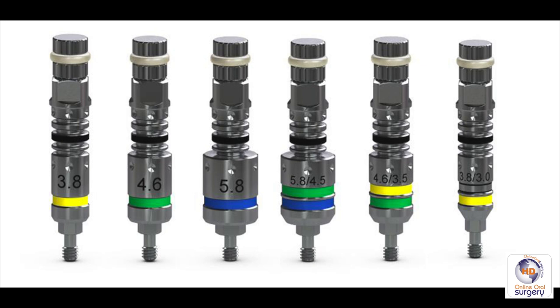Or in the posterior, if I've got some limited space, I can put the implant fixture directly on the implant mount, place it with a hemostat into the master sleeve and the drill guide, and then attach the handpiece adapter to it once it's in position.